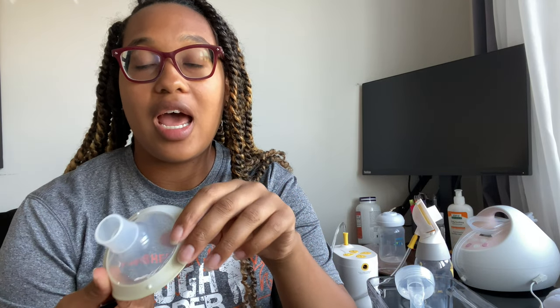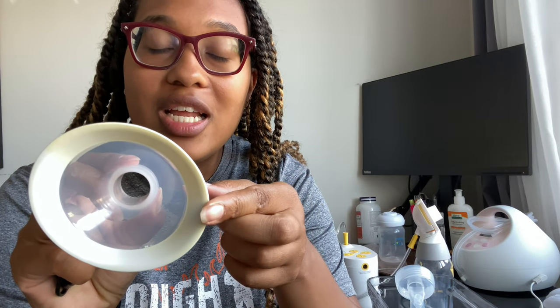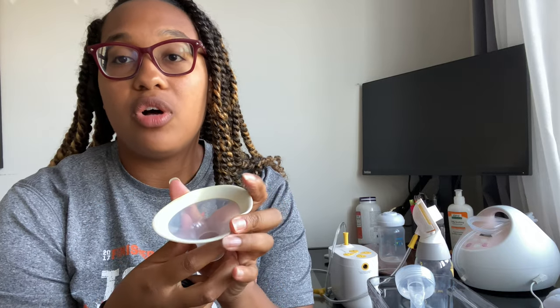I use the Medela Pump in Style at night because I love these flanges. Now these actually don't come in my proper size - the smallest size they come in is 21. I love it because of the feel of this part. The only thing I don't like - and you'll see if I bring it close - is there's a little yellow staining on this one. This is an old one I'm throwing out; I kept it just to show you. It can stain, though I have other ones that haven't gotten stained after a couple months of use.